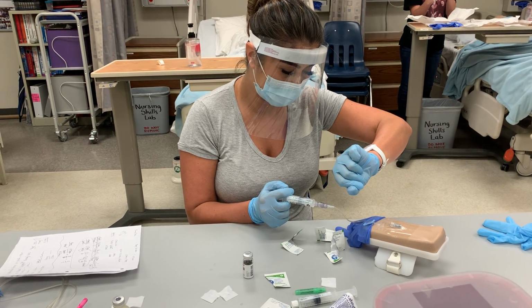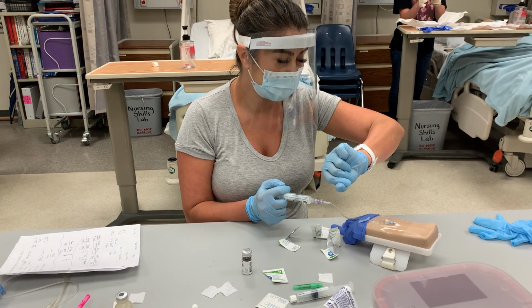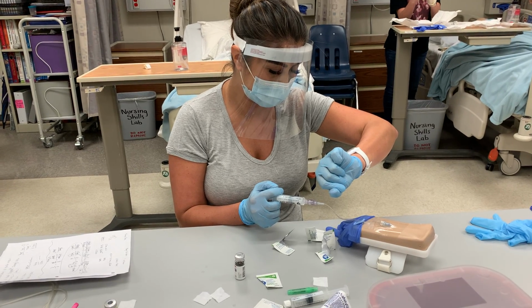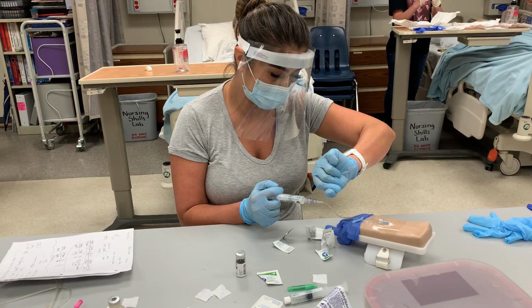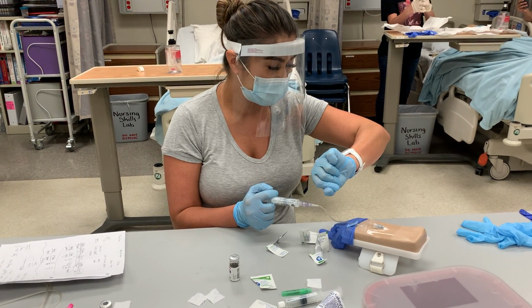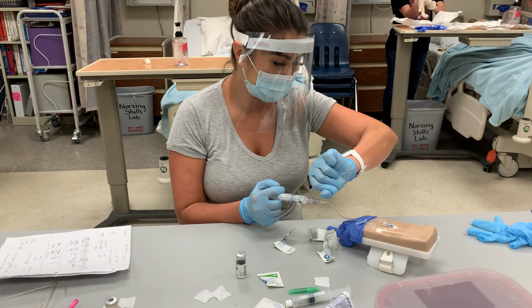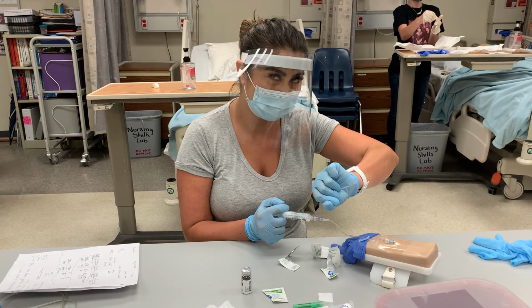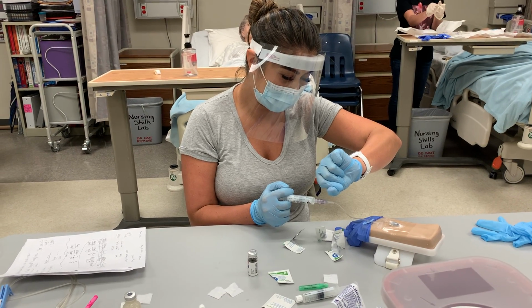After verifying the order, I will gather my supplies. You would open it first to make sure that everything's in there. Okay, it's been 1 minute. I'm going to continue to push.